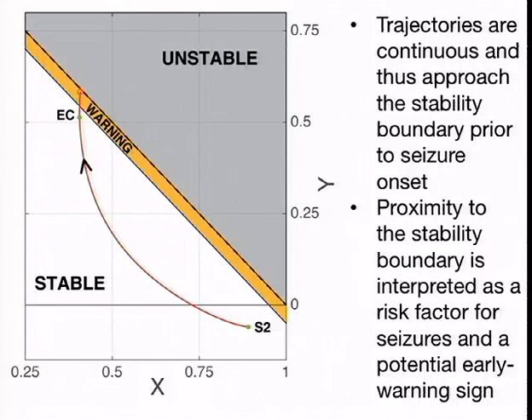Well, as far as I understand, you're using this model basically to translate or to reduce the power spectrum parameters into a few generated parameters within some neural field model. But the question is, what is indeed the added value of the dynamics of this model? Because you have tracing trajectories, but these trajectories are not autonomous. In a sense, there is no dynamics along this trajectory, and it's only dynamics on the specific point in the parameter space that generates the spectrum.